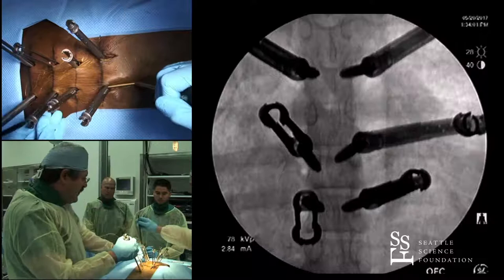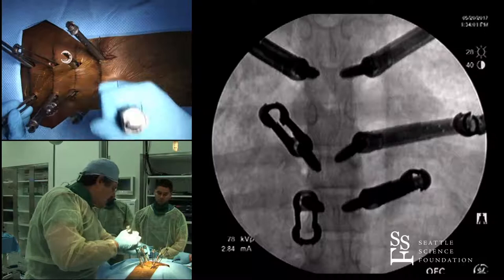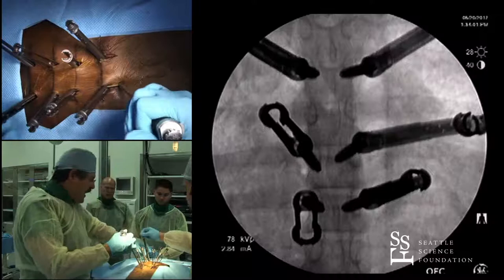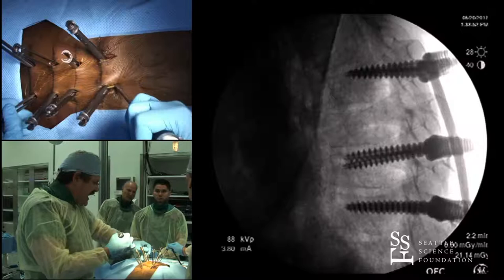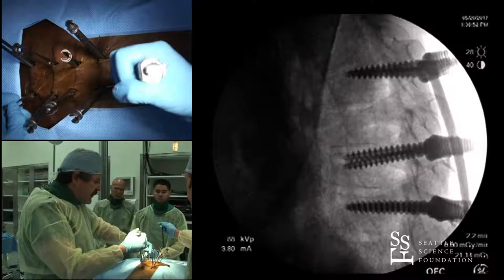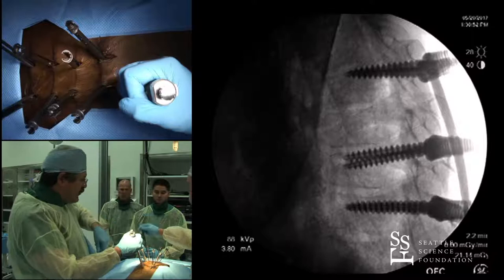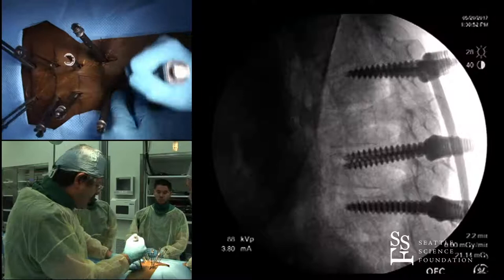Once I think I'm through, I drop the rod down. If I move the rod up and down I can see how it moves the insertion tool — if I'm not in the screw, the tool doesn't move. So I verify it's through one screw, then grab the next. I can feel it and check each one. If it's not through, I'll take a picture and see that my rod is up to the screw, meaning I'm a little medial or lateral. I have a curve to my rod and can feel it stabilize the screw when I'm through.